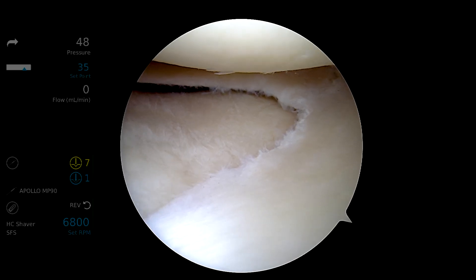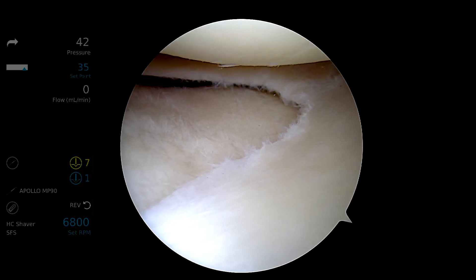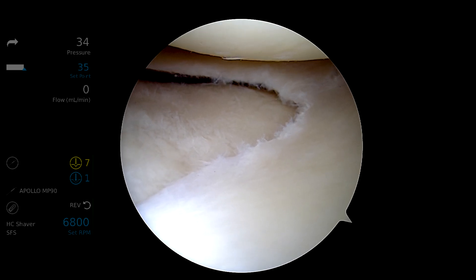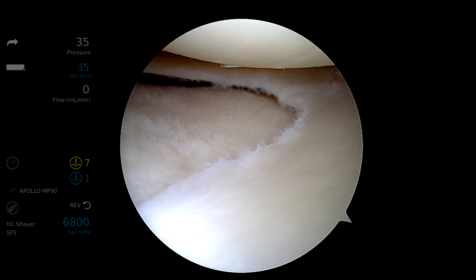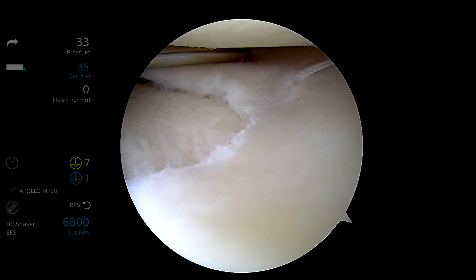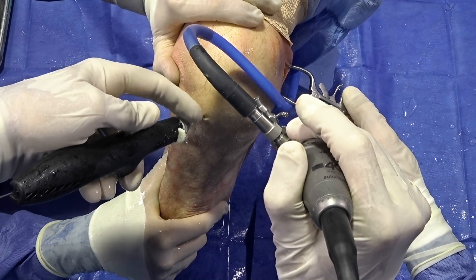Another suture configuration that we'll commonly use now is a circumferential stitch to repair horizontal cleavage tears, in order to prevent resecting an entire leaflet and removing all function of the meniscus. This can also be easily performed with the Zone Navigator.